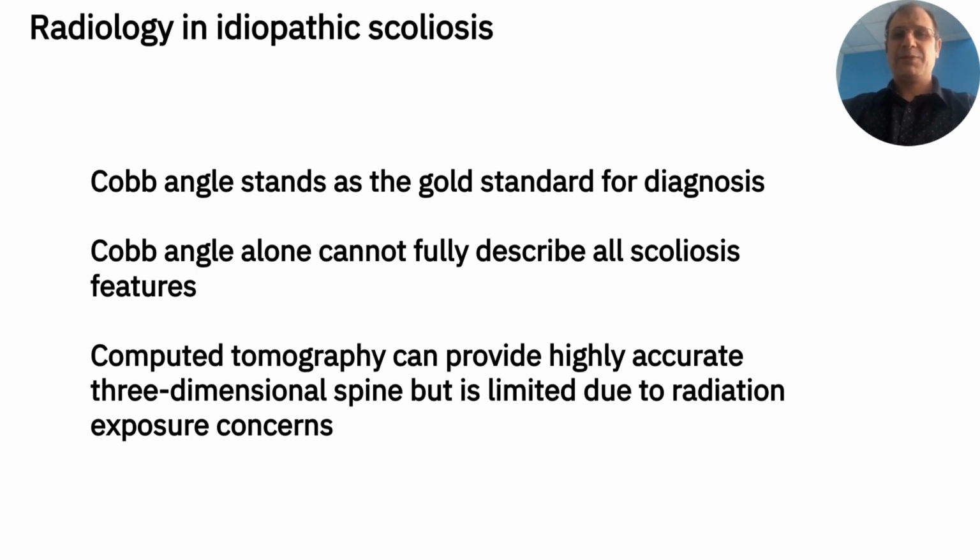Among the various measurement methods, the Cobb angle stands as the gold standard for diagnosis and monitoring of changes in adolescent idiopathic scoliosis. However, the Scoliosis Research Society recognizes that the Cobb angle alone cannot fully describe all scoliosis features, making it insufficient as a sole monitoring parameter.